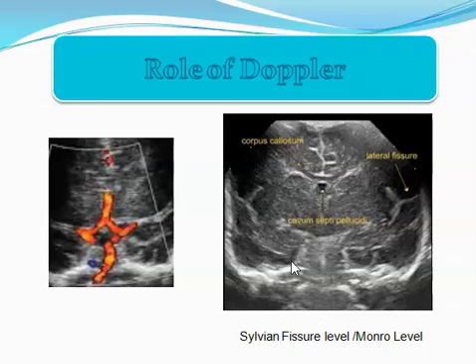So when you see this star-shaped structure, and you turn the color Doppler on and put your box over here, you will see these very nice cerebral arteries: this is the middle cerebral artery, this is the anterior cerebral artery, this is the posterior, and this is the right middle cerebral artery. Even if you cannot evaluate the rest, the middle cerebral artery is a bigger artery, and you can very easily recognize the arteries. So this is the area where you can see the circle of Willis.